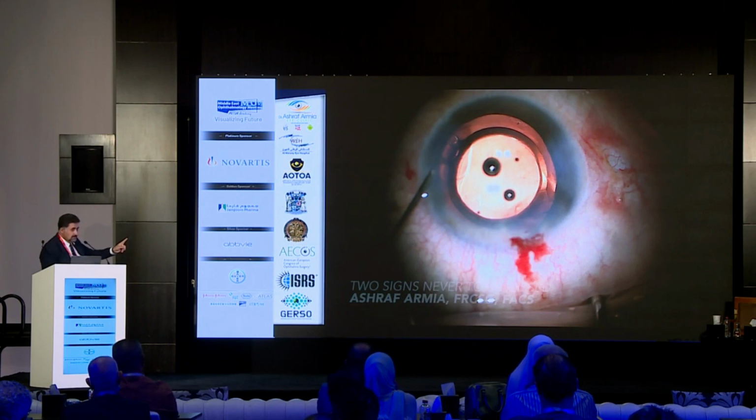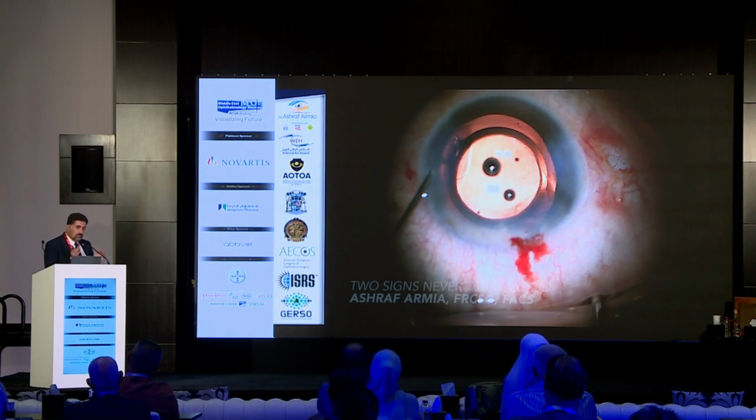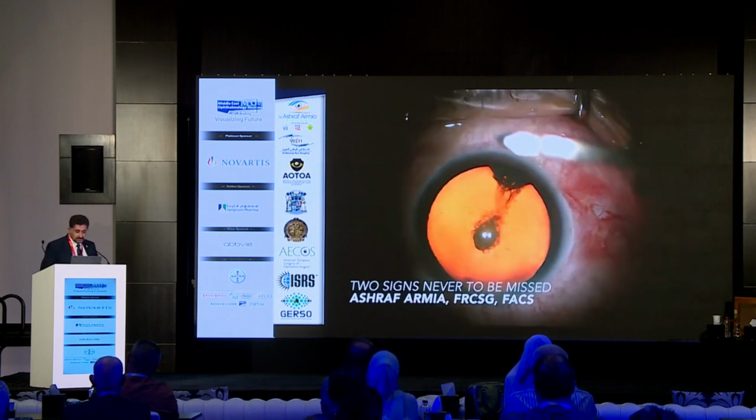Why did this happen? Because you know the history. You examine the patient properly on the slit lamp, you prepare all your tools before surgery, and then you continue the surgery. This is the first case.